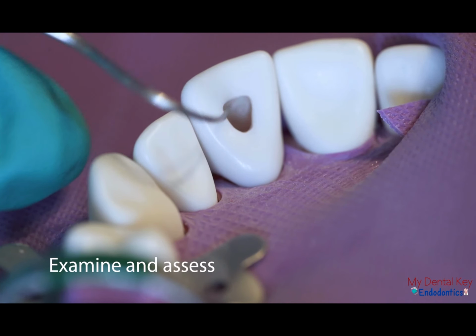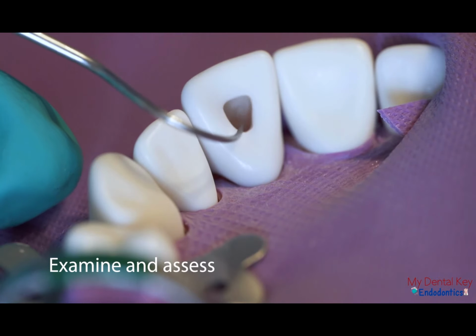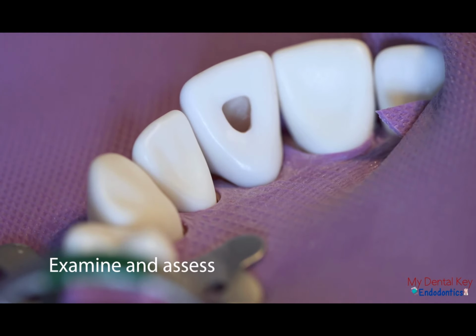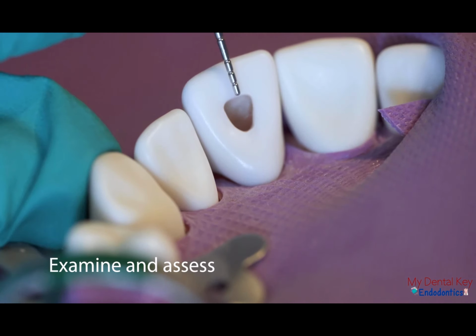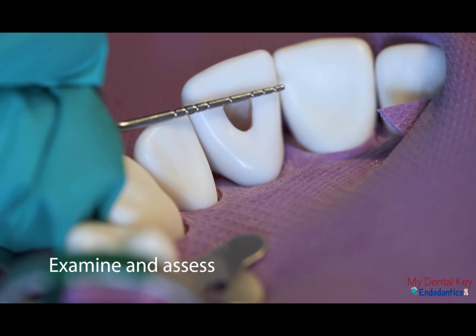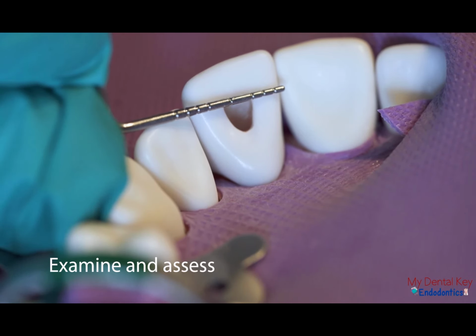It's time to examine and assess the access opening. Be sure that your access opening has smooth walls and straight line access. For the CDCa, your access opening should be 3 mm from the incisal edge, 4 to 5 mm from the CEJ, and 3 mm at the base of the access opening mesiodistally. The width of the preparation should be no more than half of the lingual surface width mesiodistally. The marginal ridges should be kept intact. Additionally, your access opening should be about 2 mm from the distal aspect of the marginal ridges.